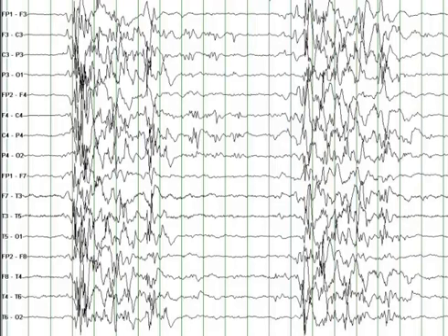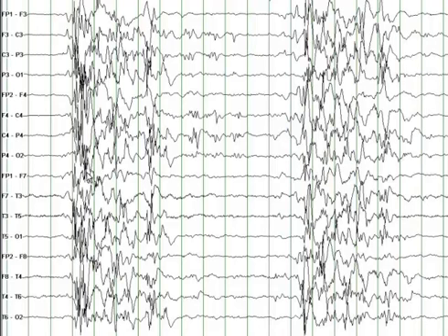The prognosis of a burst suppression pattern obviously depends on the underlying etiology. This particular patient was diagnosed with Ohtahara syndrome. One of the typical features of burst suppression in this syndrome consists of bursts that last from four to six seconds, with delta and theta activity intermixed with spikes and sharp waves, and periods of suppression lasting for approximately four to six seconds.